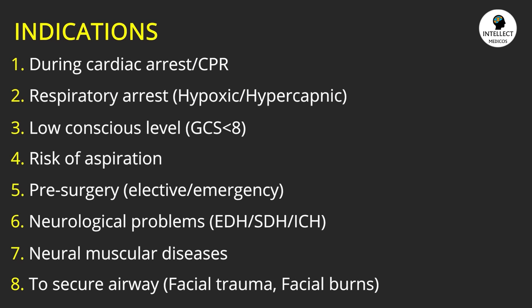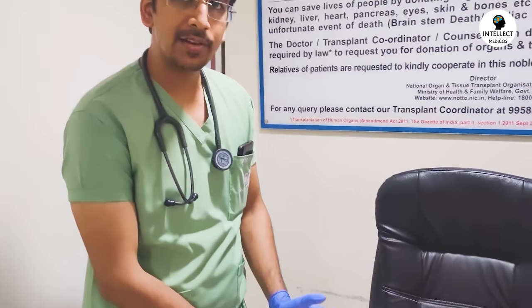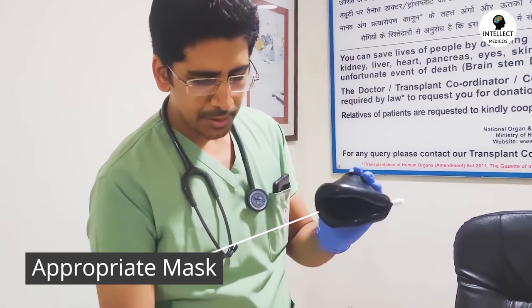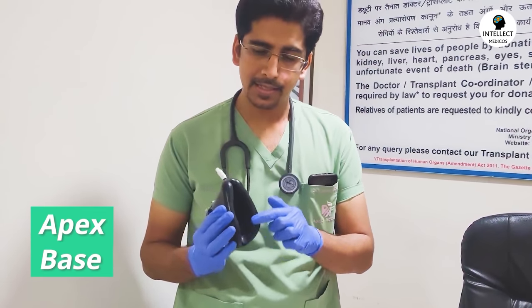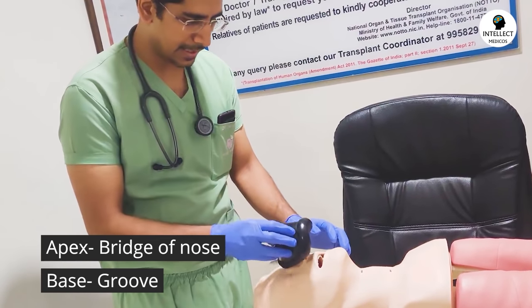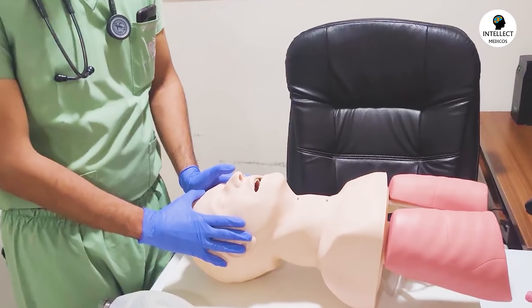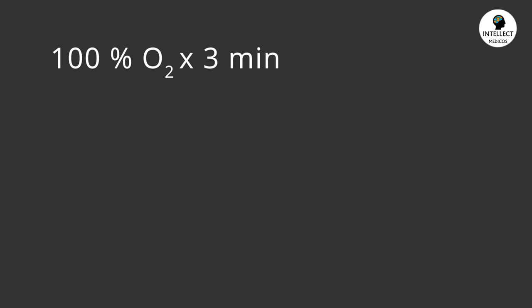Now coming to the equipment required during intubation. First, this is our mannequin on which I will demonstrate the procedure. This is the resuscitation bag and the mask — we need different sizes of mask. To check if the size is appropriate: the apex of the mask should lie at the bridge of the nose, and the lower margin should sit in the groove between the lower lip and the chin. Before giving any drugs, you need to administer 100% oxygen via Bain circuit for at least three minutes — this is called pre-oxygenation.